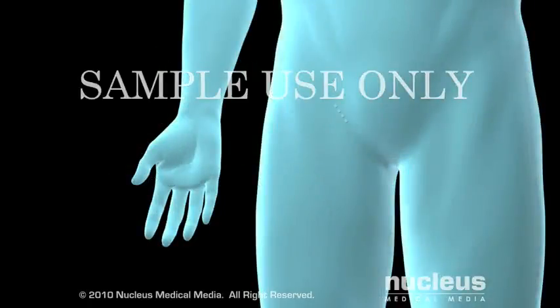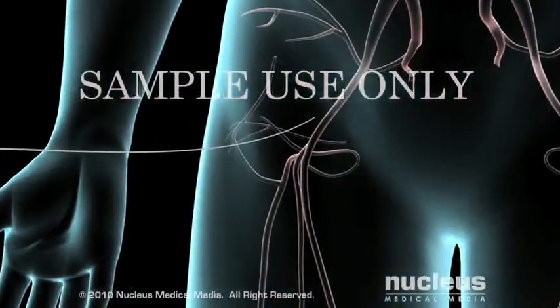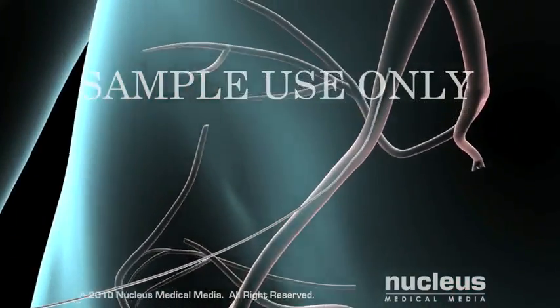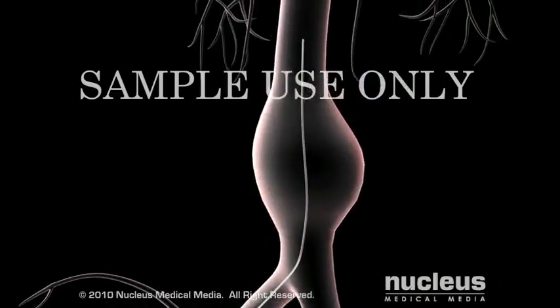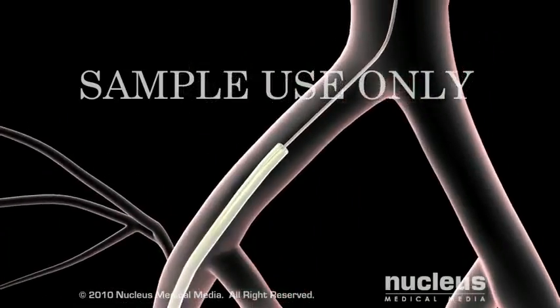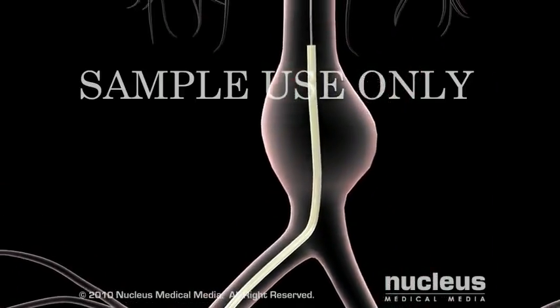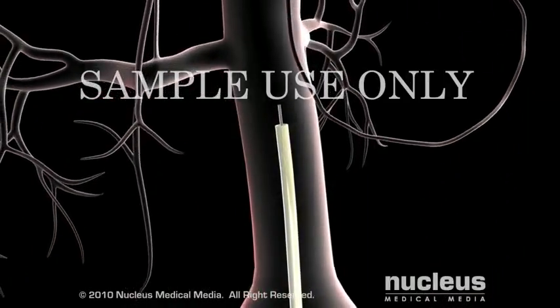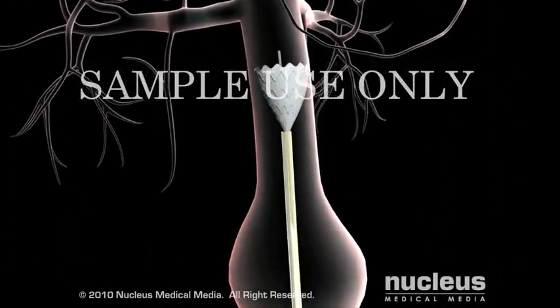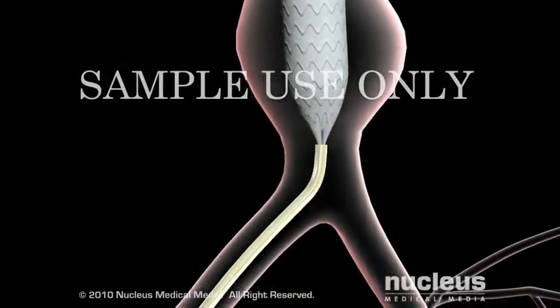Your surgeon will begin by making a small incision in your groin over your femoral artery. Then he or she will insert a guide wire into the artery and gently push it up toward the site of your aneurysm. A catheter or hollow tube will be passed over the guide wire and pushed toward your aneurysm. Using live X-ray pictures as a guide, your surgeon will pass an endovascular stent graft, a compressed fabric and metal tube, through the catheter to the aneurysm.